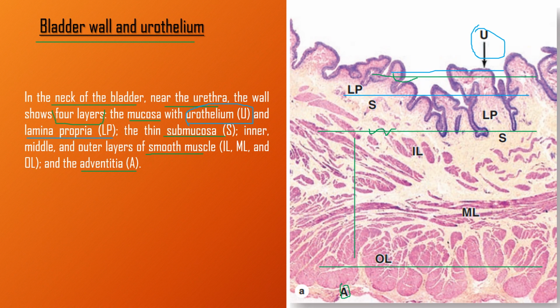Got it? Then the submucosa is very thin as compared to other layers. As you can see here, this is the submucosal layer, which is thin.